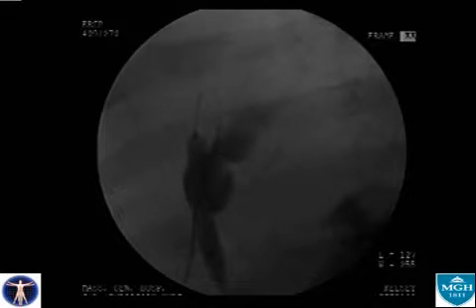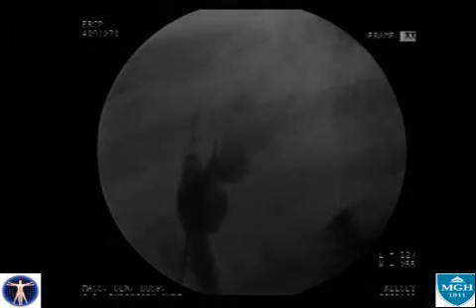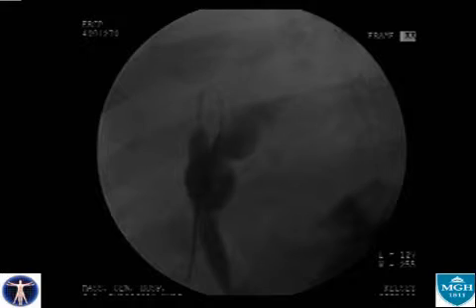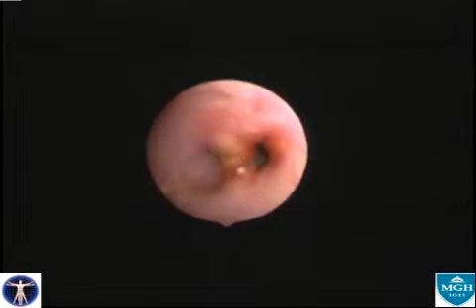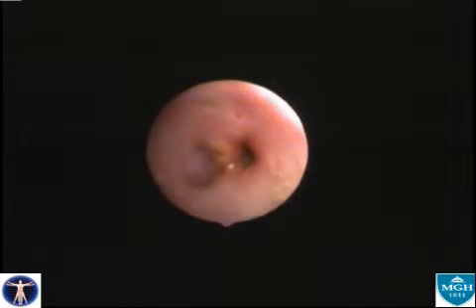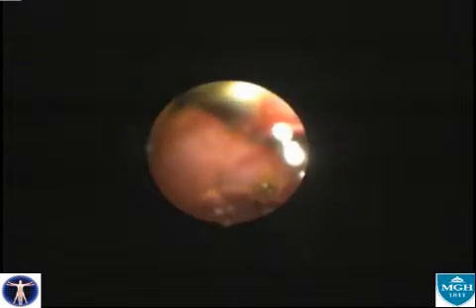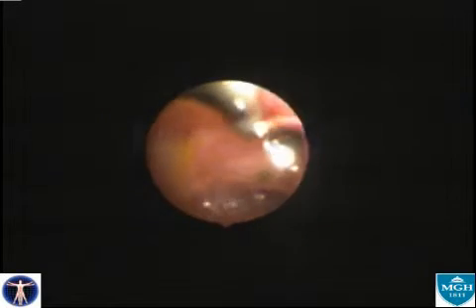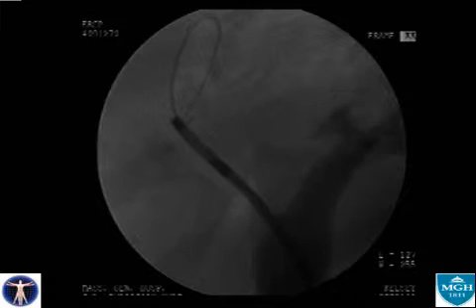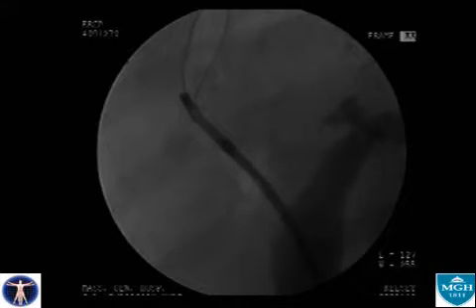The balloon assembly is then removed, and the cholangioscope is advanced into the area. The scope visualizes the recently dilated stenosis, which is puckered and slightly edematous. In order to facilitate scope passage into the correct duct, a guide wire is passed under direct visual and fluoroscopic observation. Once the wire is in place, the scope can then gently be nudged through the stenosis and over the wire and up into this area.